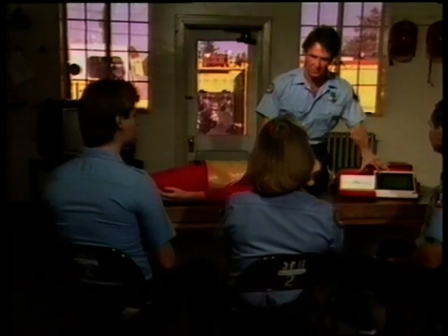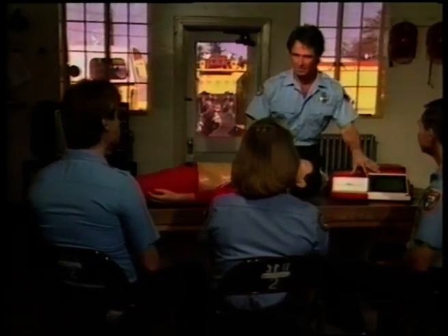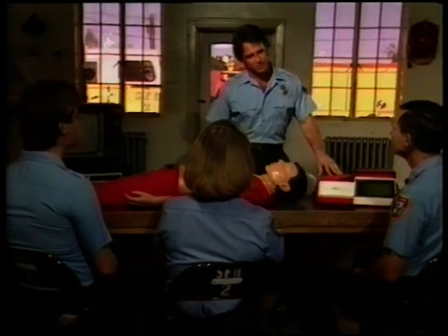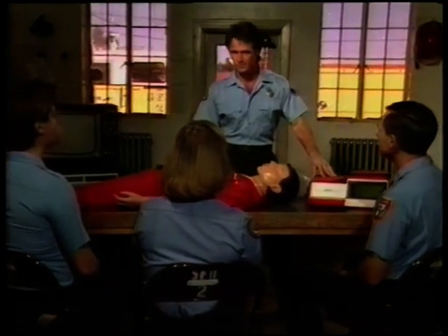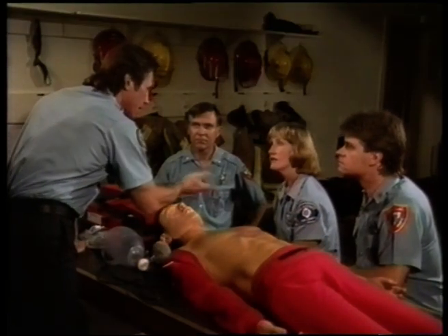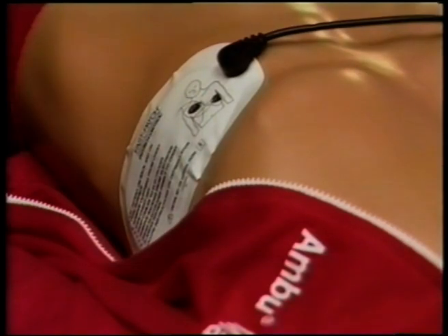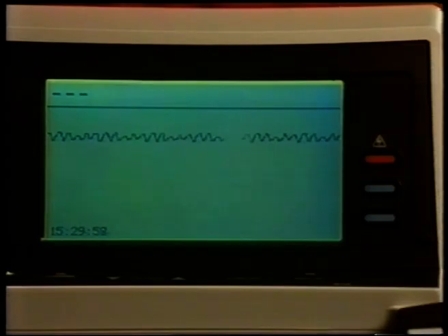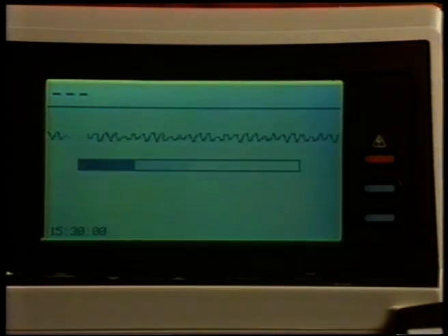The LIFEPAK 300 is called an automatic advisory defibrillator. In a cardiac arrest, it has the built-in intelligence to recognize ECG waveforms and recommend whether or not a shock is advised. The LIFEPAK 300 is sophisticated, yet simple and easy to use when the operating instructions are understood. The LIFEPAK 300 receives a patient's ECG signal through large defibrillation electrodes. A microprocessor-based shock advisory system analyzes this ECG and recommends whether or not a shock is advised.